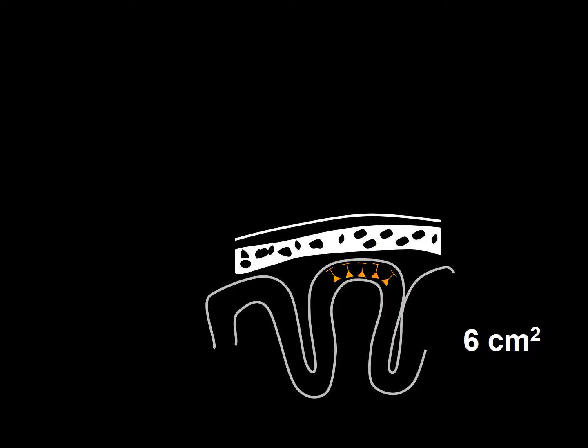Now I will use the solid angle theorem of volume conduction to explain electrical wave formation in the context of cerebral anatomy. In this frame, I have represented a layer of pyramidal cells by their cartoonish structures in the crown of a gyrus.